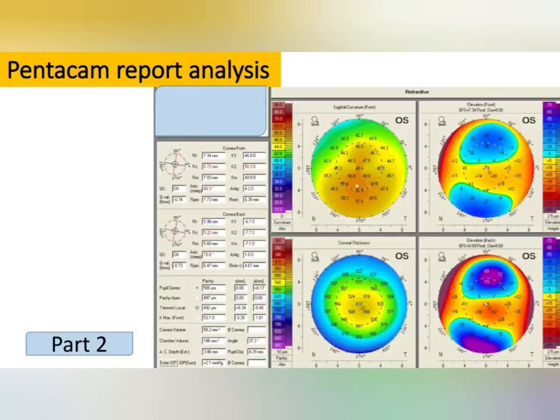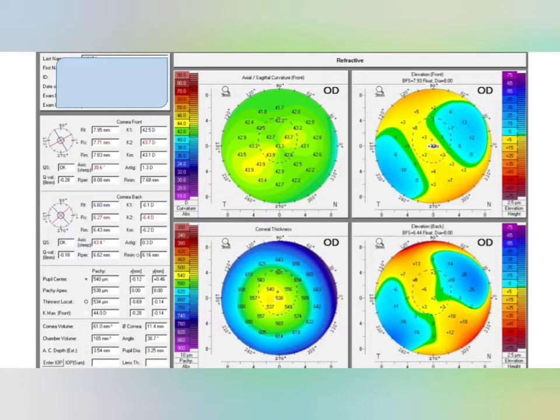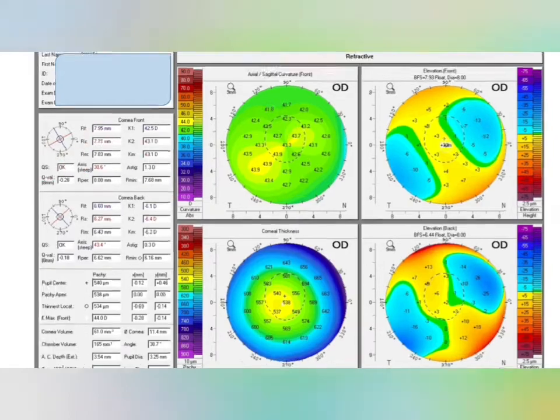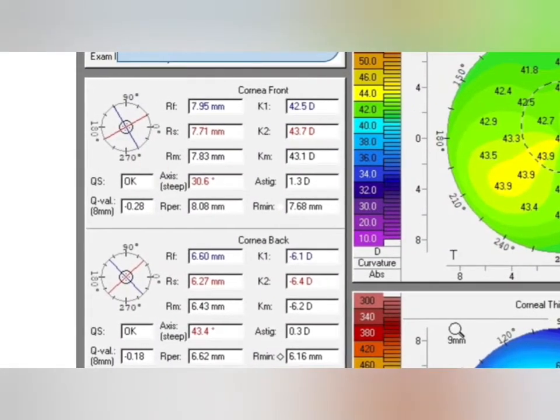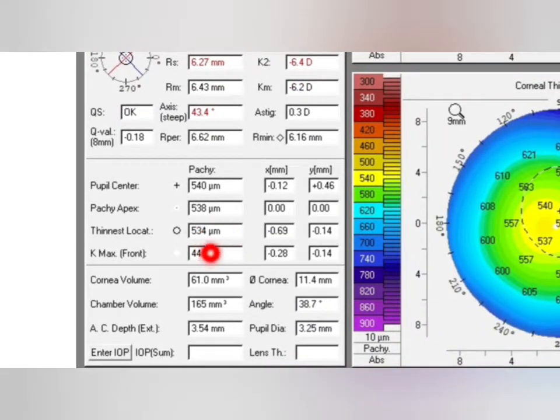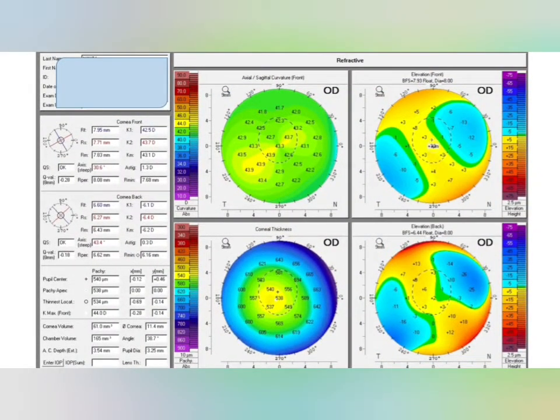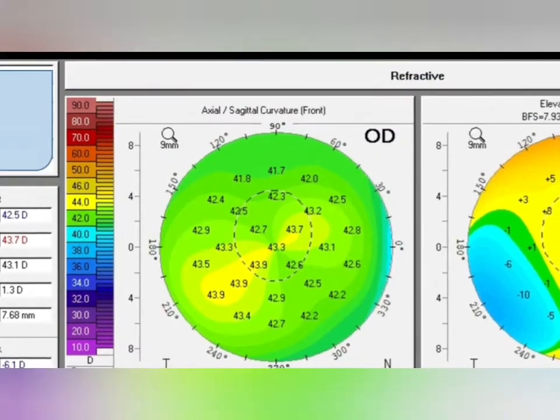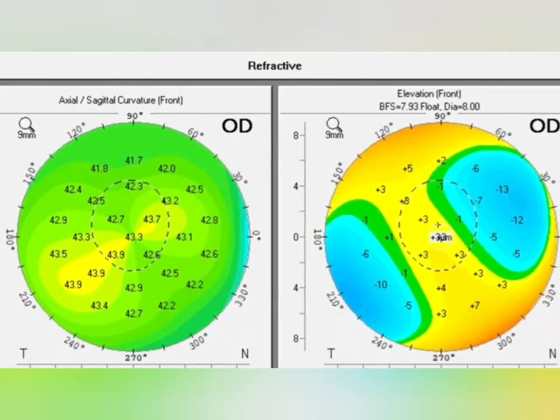Let's start with the Pentacam report analysis. First, we need to look at the QS value — it is showing 'OK', meaning the measurement taken is correct. After that, the Q value is also normal. The Kmx value is less than 47.20, which is also normal. The thinnest local is 534, absolutely normal. Y-axis deviation is minus 0.14, also in normal range. Now we look at the anterior sagittal curvature.